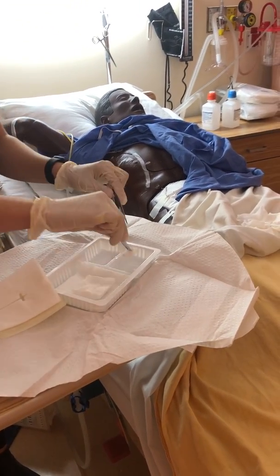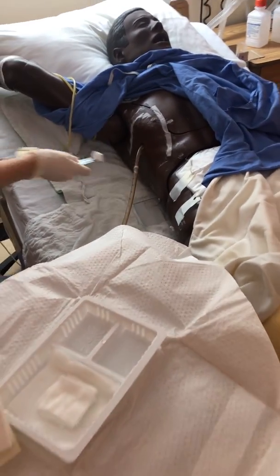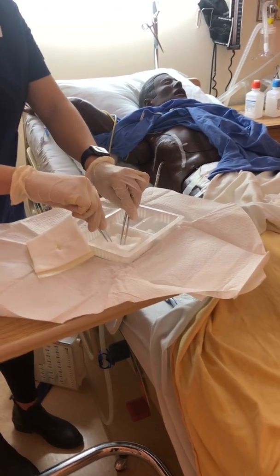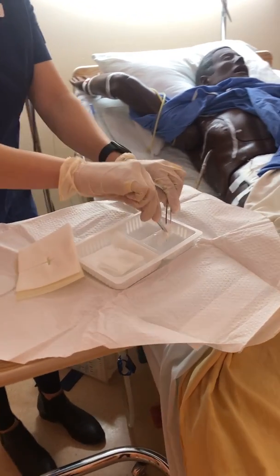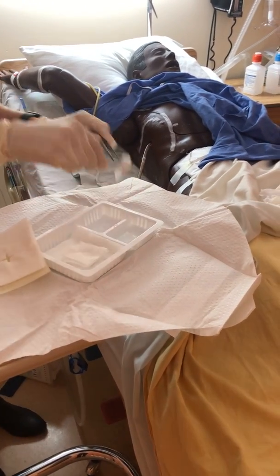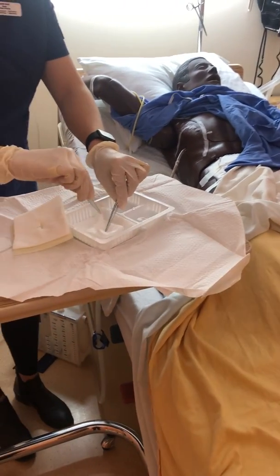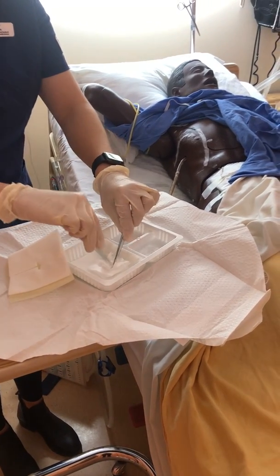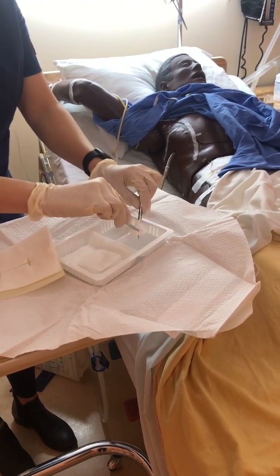Okay, again, go a little further out, 1 swipe per wipe, around, discard that, and then I will want to do a little bit on the tube, wet, rinse it out. So I'm going to do the top of the tube here, and then I'm going to do the bottom of the tube under here.